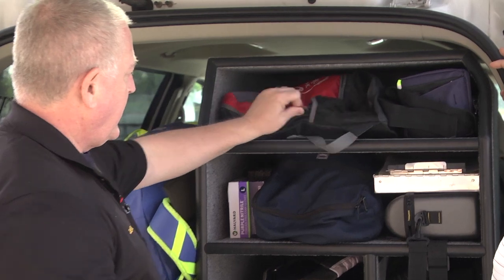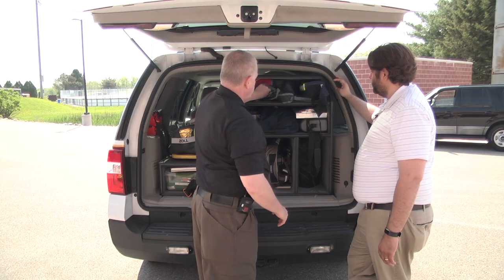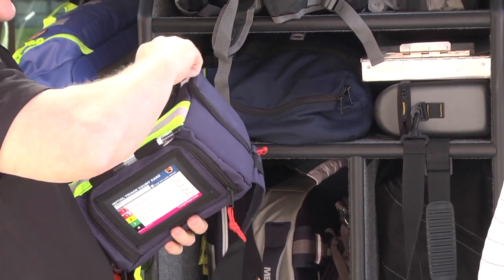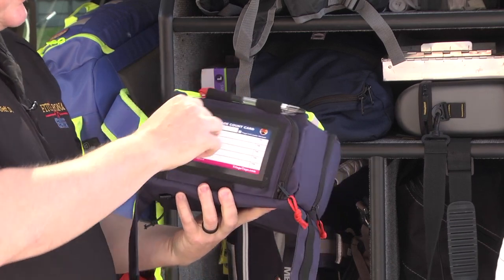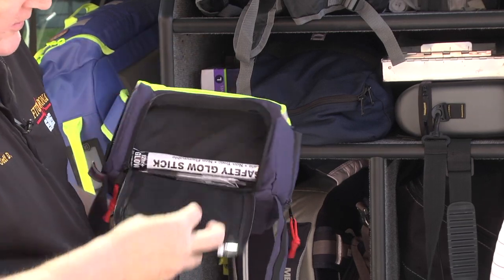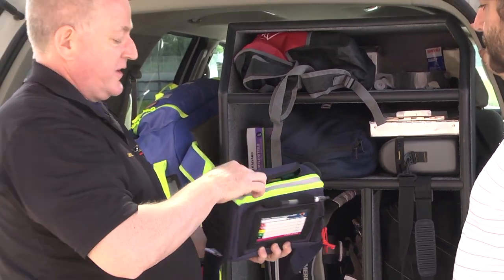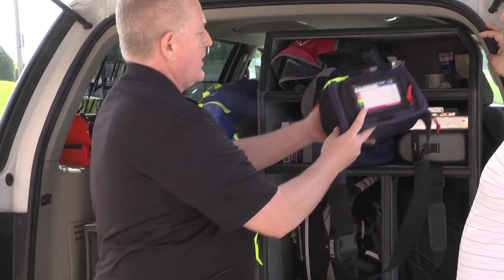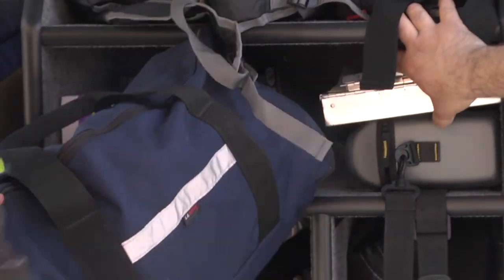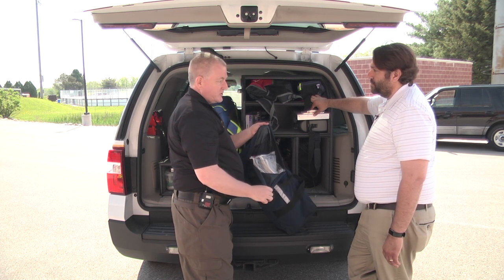So we'll just start at the top. Of course, we have our Reach a Child bag. For those kids that may need some comforting while we're on the call, Reach a Child has always been there for us. In this bag right here, we do have a triage type kit. I don't know if I can open up the big side of it here, but we can pull triage tags out of here. We can put glow sticks. A lot of times we'll use those, especially in an active shooter, if that place has been cleared. Triage ribbon tags are in there. So just quick stuff for us. C-collars, suction machine, gloves, all of those things that we use all the time. Mobilization stuff, we can use as well.